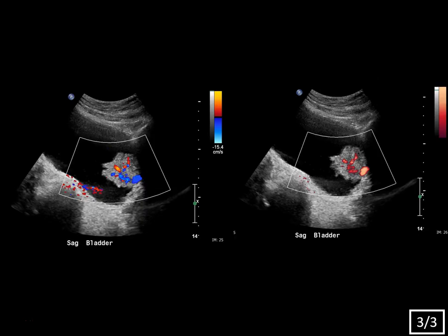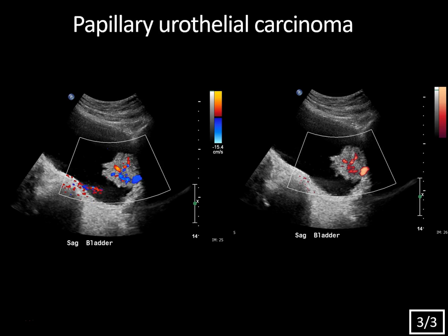Color and power Doppler imaging are super helpful when evaluating a bladder mass because an isolated blood clot will not have vascular flow, but a neoplasm typically will. In this case you can see extensive intratumoral flow on both color and power Doppler imaging. This was resected and found to be papillary urothelial carcinoma, the most common bladder cancer, also known as transitional cell carcinoma. It will typically have this polypoid appearance with frond-like margins and vascular flow.